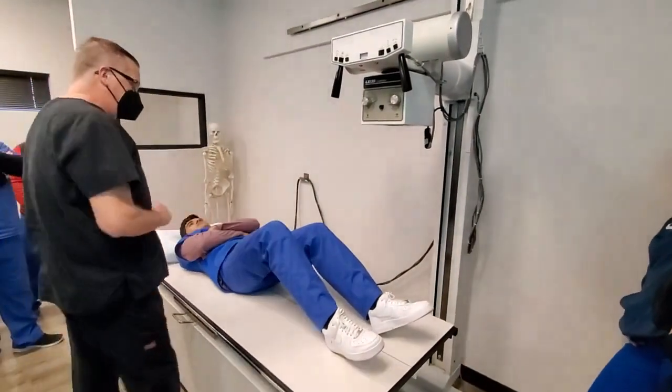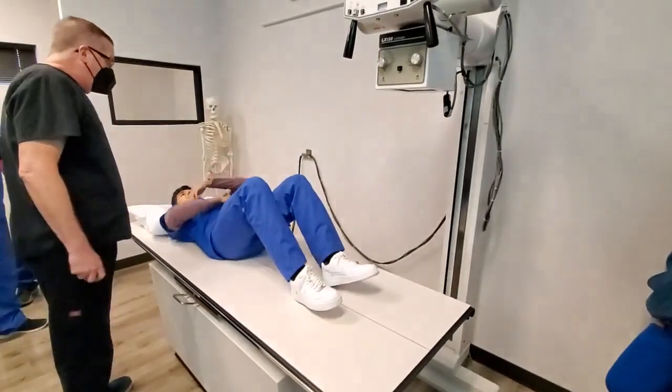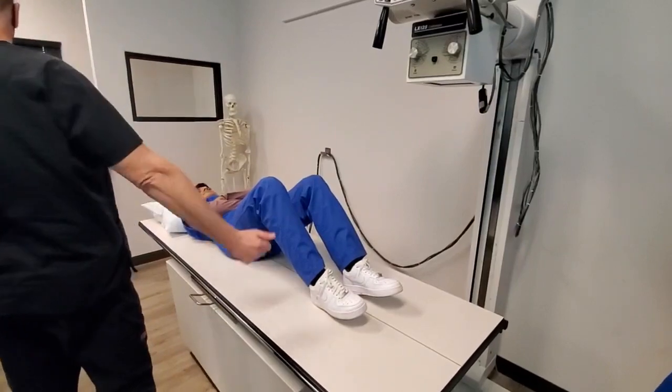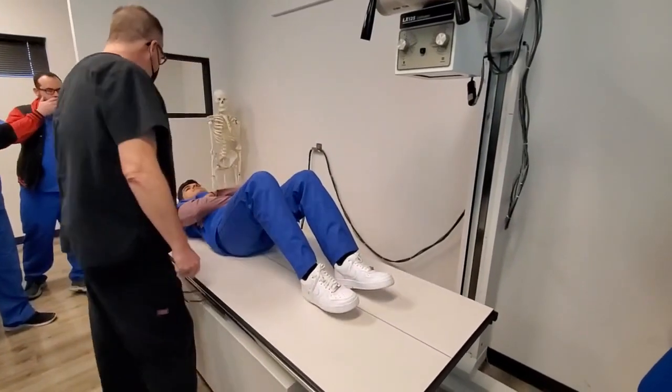We're going to be doing an AP knee — the right knee of Mr. Daniel here. Scoot up on the table a little bit for me. Best to start, as always, with the table in the middle of the base. Don't have it on either end; that way we don't overload the table. Right knee is hurt, correct? Yes, sir.